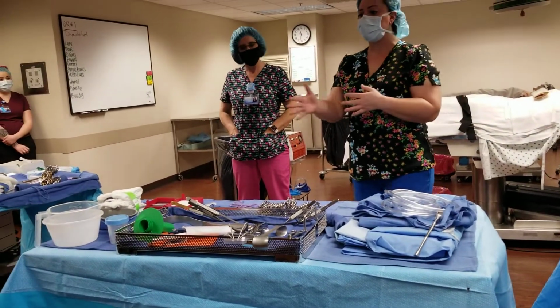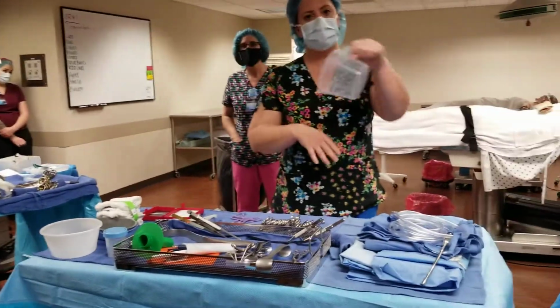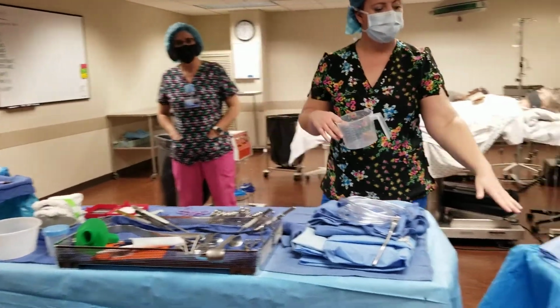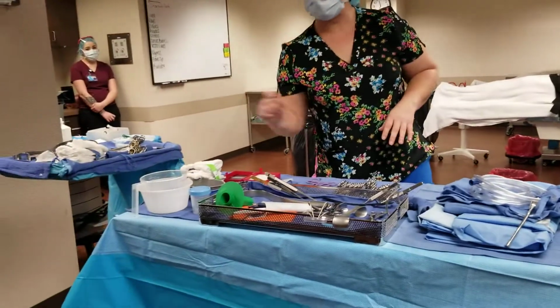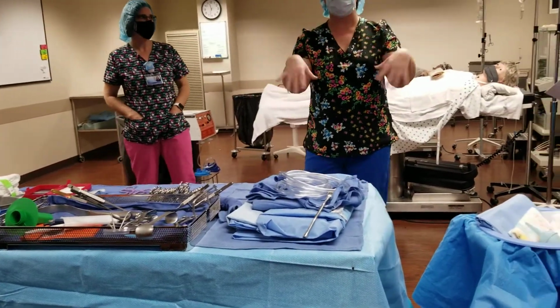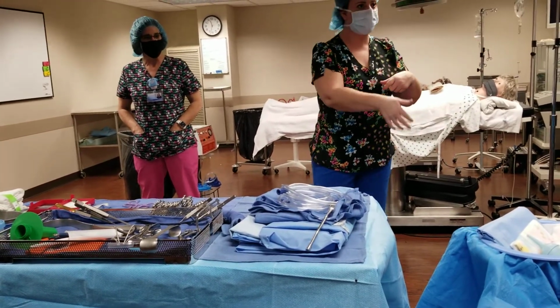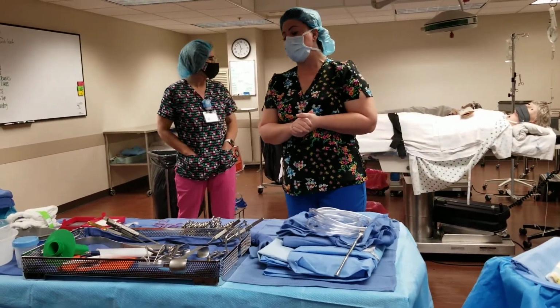All right. So they're not going to use an asepto. Notice we don't have an asepto. You're just going to give them the bucket. They're going to pour it in. So when we do it, maybe we can just use this blue basin. A lot of times when I did C-sections, we would have the double ring stands and you would have a double basin. So one you put sterile water in, and then that way your bloody instruments can go in there when you're done with them. But it's not a have.